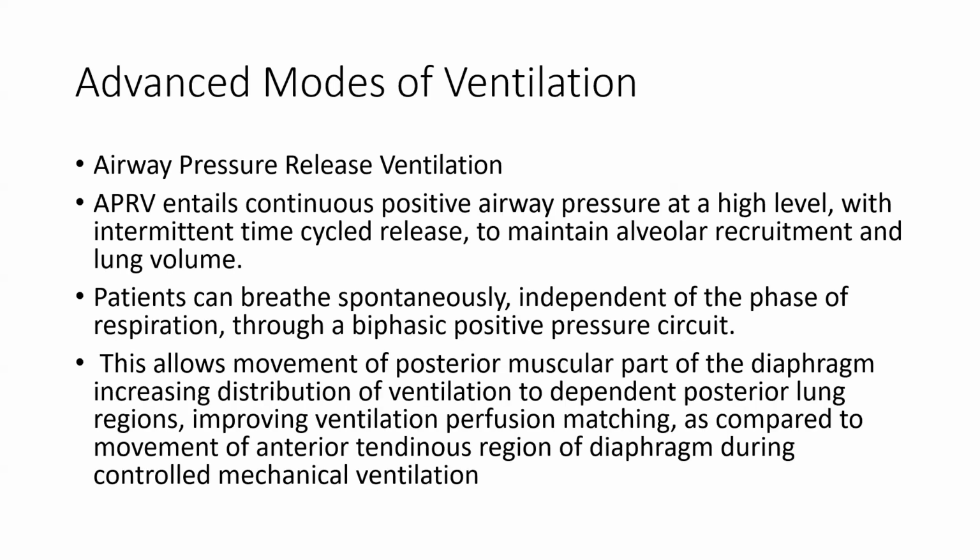PRVC should therefore be used in patients who have a stable respiratory drive. Now about advanced modes of ventilation, airway pressure release ventilation. Airway pressure release ventilation entails continuous positive airway pressure at a high level with intermittent time-cycled release to maintain alveolar recruitment and lung volume. So the patient can breathe spontaneously independent of the phase of respiration through a biphasic positive pressure circuit.